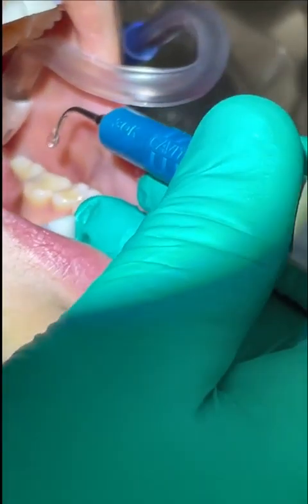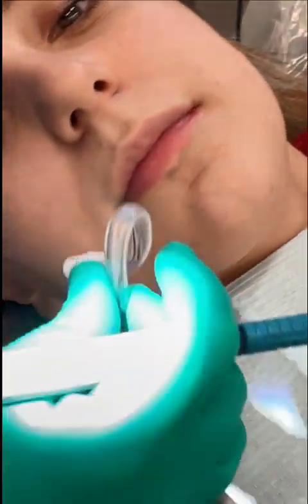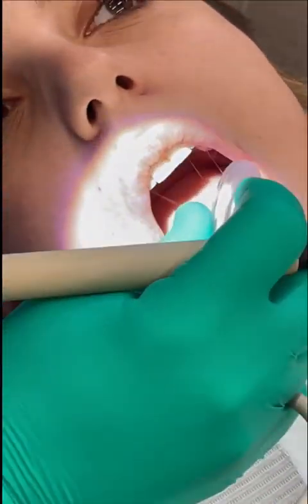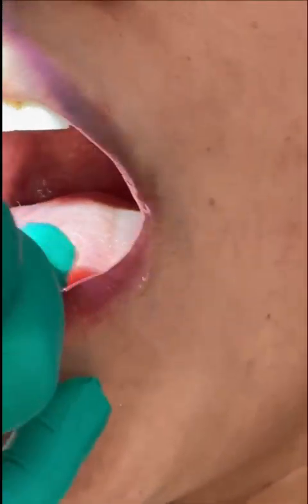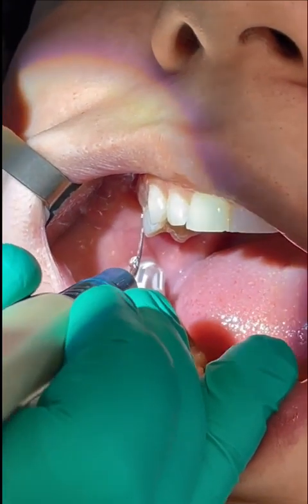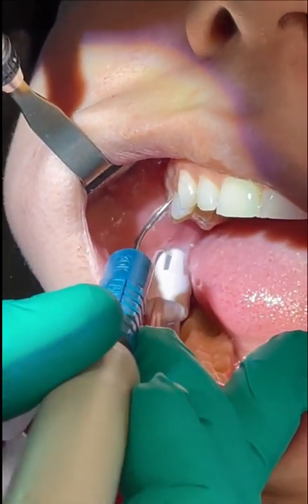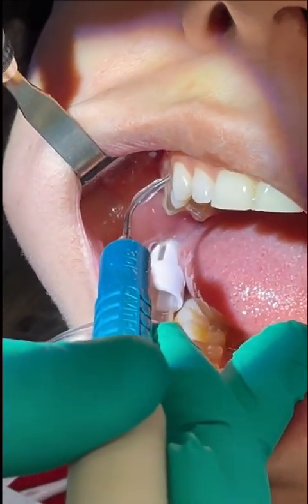Now I'm finished with the left side. I have the patient turn their head to the right, and I hang the suction on the right side of the mouth. I don't need to readjust the suction because it's all set for the upper right side. I'll proceed with much the same technique as the left side, moving into the 12 o'clock for the anteriors and so forth, but on the right side, the surfaces towards me are going to be the buccal surfaces, and the lingual surfaces are the ones that will require indirect vision.